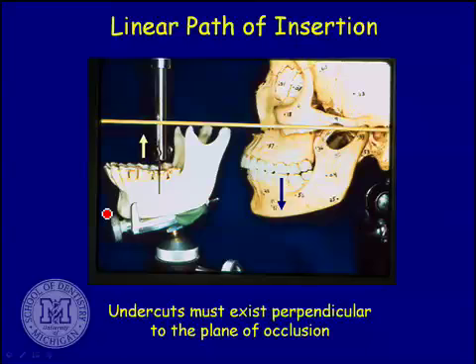So anytime you're eating sticky foods, once your teeth come together, when you start to open your mandible, open your lower jaw, during the first millimeter to 2 millimeters of opening of your lower jaw, can everybody see that the direction that your lower jaw is going to move is pretty much perpendicular to the occlusal plane? I know the jaw opens on an arc, I know that. But can you see just the first 2 millimeters of movement? That first little teeny bit is pretty perpendicular to the plane of occlusion. And once you've opened 5 or 6 millimeters, the partial's already off the teeth.